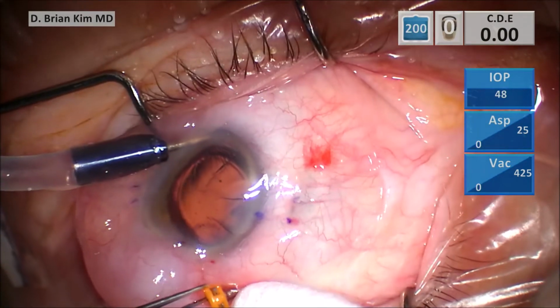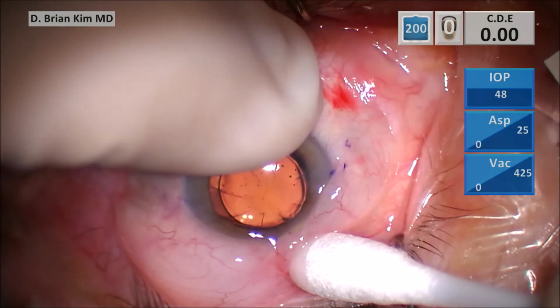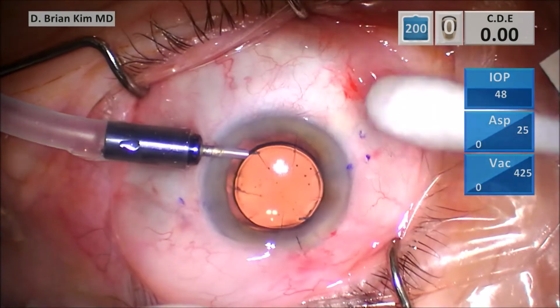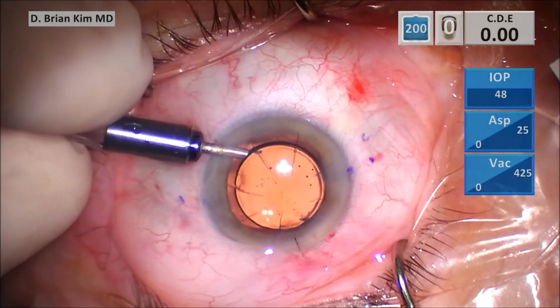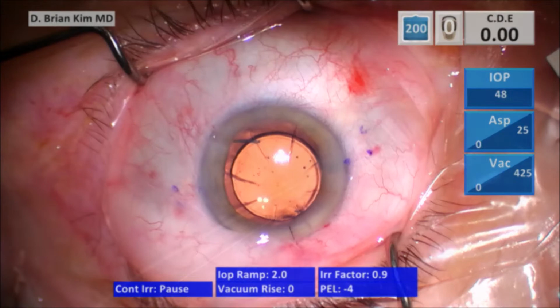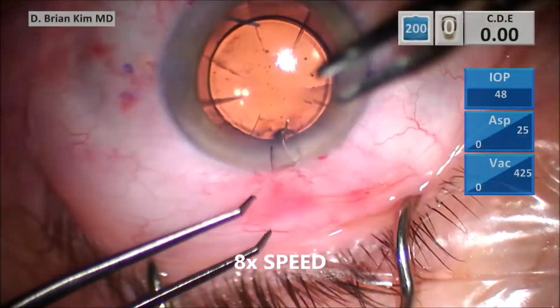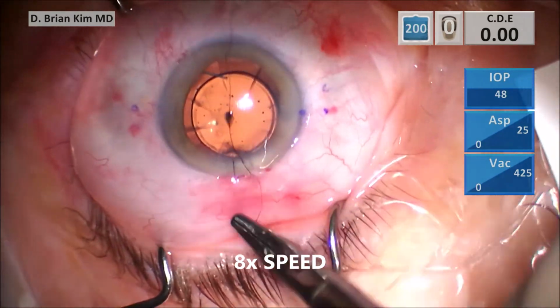Pulling the trocar out. As I'm pulling it out, I'm using the cotton tip to tamponade the sclerotomy. And once I do this, I'm just checking the eye pressure, turn on infusion, and you can see there's no ballooning of the conjunctiva. So you can see, again, 2 trocar incisions, both self-sealing, making sure I'm tangential through the sclera as I tunnel and then dive down towards the nerve.